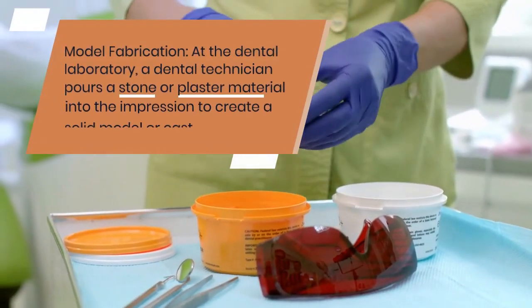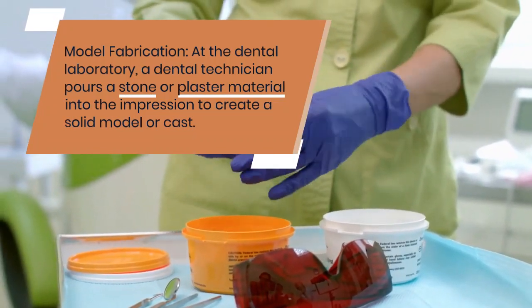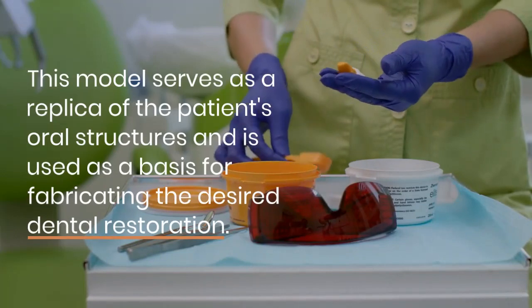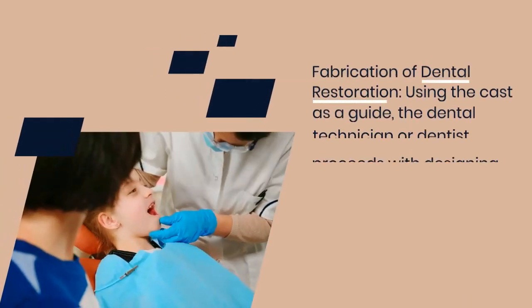Model fabrication. At the dental laboratory, a dental technician pours a stone or plaster material into the impression to create a solid model or cast. This model serves as a replica of the patient's oral structures and is used as a basis for fabricating the desired dental restoration.